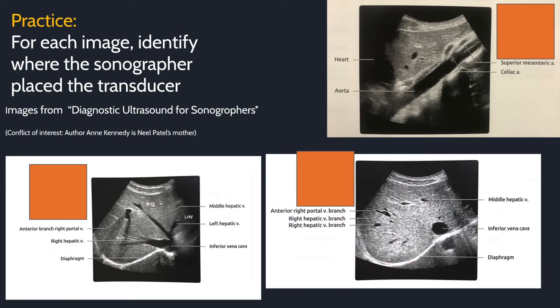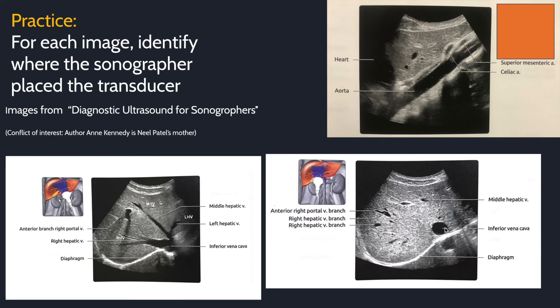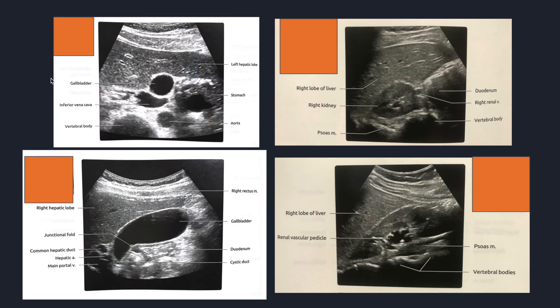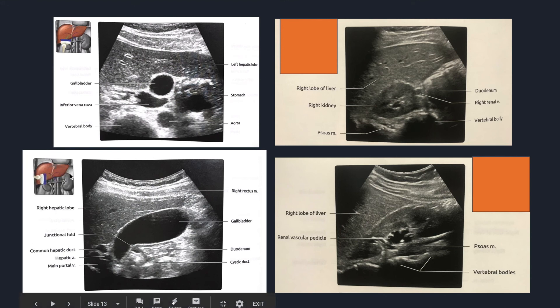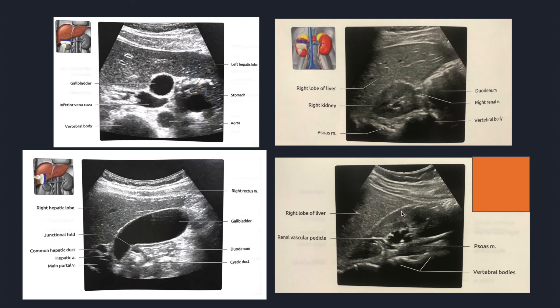To finish up, let's do some practice. Look at these images and see if you can identify where the sonographer placed the transducer. Transverse through the liver, looking superiorly — you can see the hepatic veins draining into the IVC. Transverse through the liver but more inferior, because the IVC is a circle and the hepatic veins are further out. Long axis of the liver. Transverse through the gallbladder. Long axis through the gallbladder. Short axis through the kidney. Long axis of the kidney.